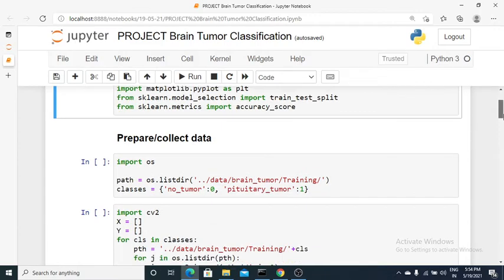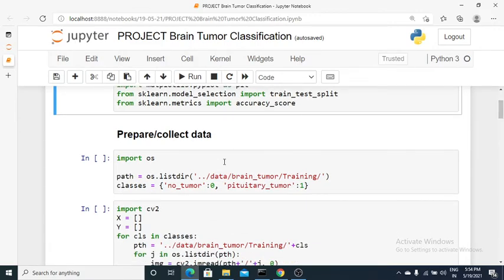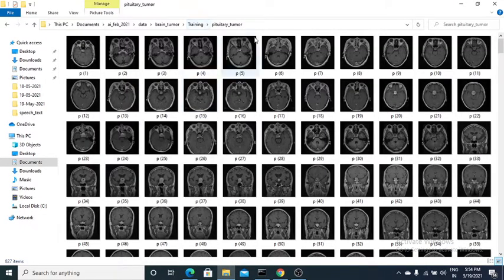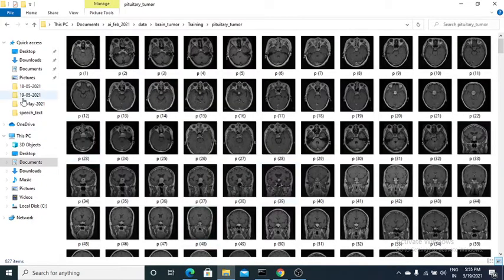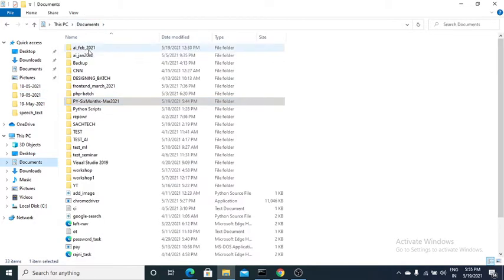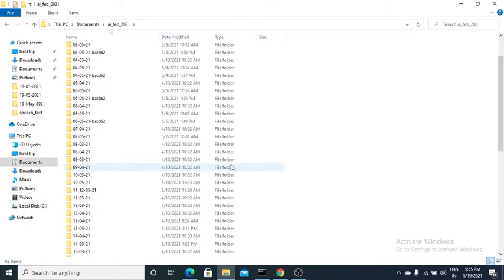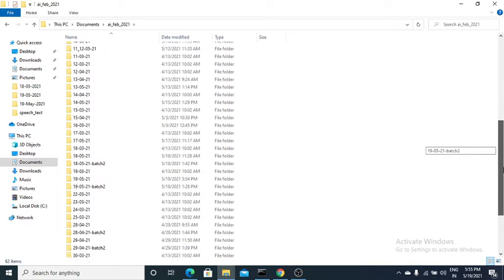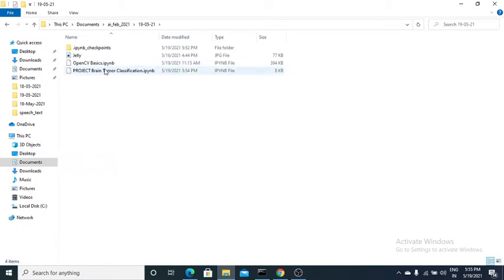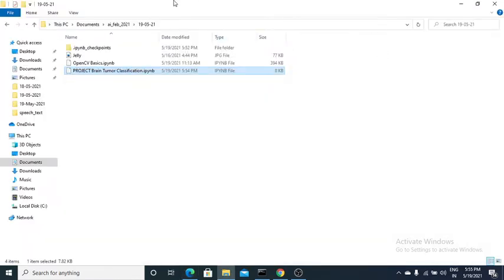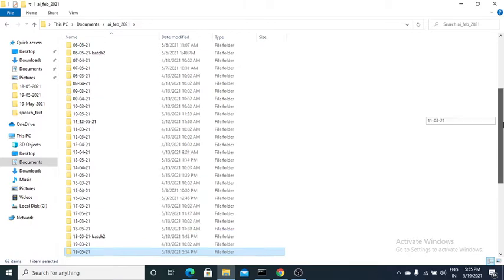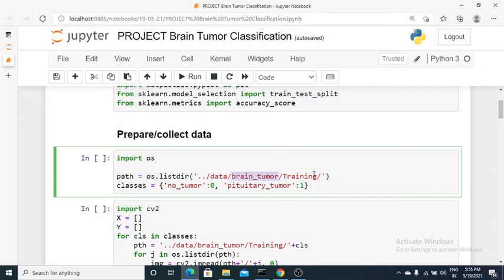I've used a command to assign a path variable for the training or testing folder. The path is something like documents/ai/feb2021, and my file is inside a May 2021 folder under project brain tumor classification. I assigned the path as one folder outside — data/brain_tumor/training — using dot-dot slash notation.